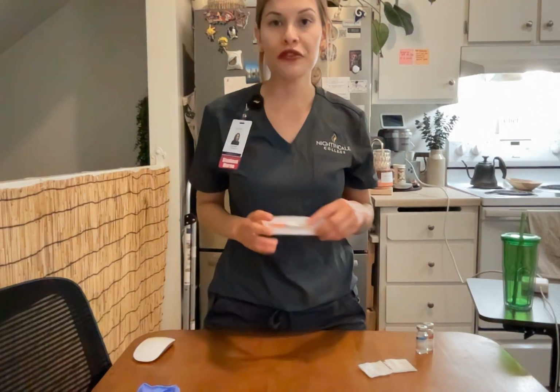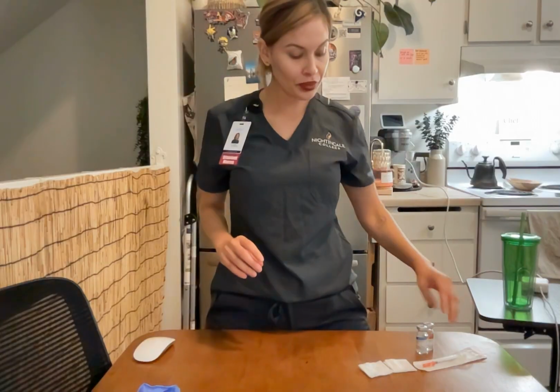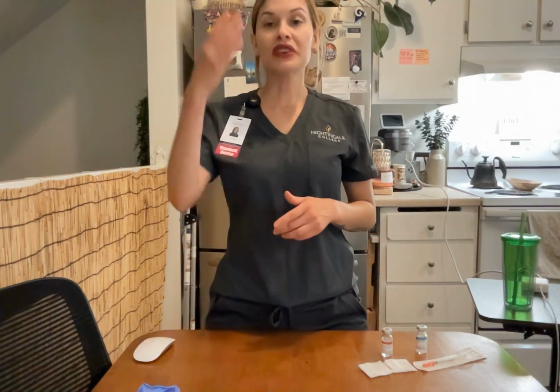I'm going to use a 50 units insulin syringe, regular and NPH insulin vial. First, I will verify the healthcare provider's order. Next, I will verify the 6 rights of medication administration: right patient, right medication, right dose, right time, right route, and right documentation.